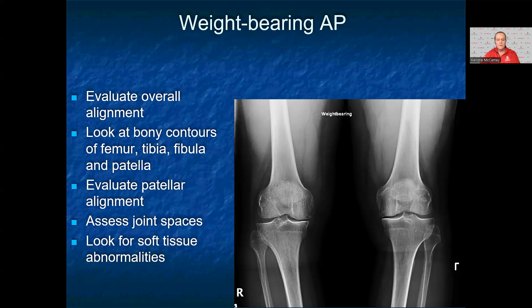You want to comment on the medial and lateral joint spaces, noting if there is narrowing, sclerosis, or cystic changes that can be seen with degenerative changes. After you evaluate the bone, look at the soft tissue for any abnormalities. For this x-ray, the patient has normal alignment but mild medial joint space narrowing bilaterally with sclerosis prominent in the medial joint lines.